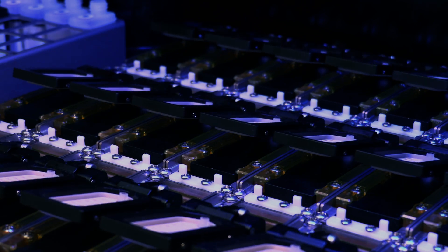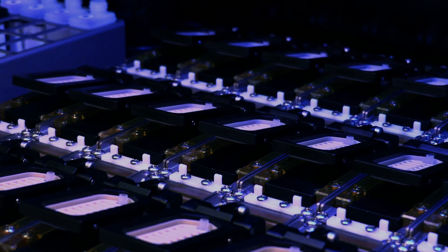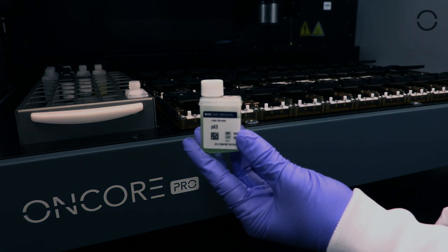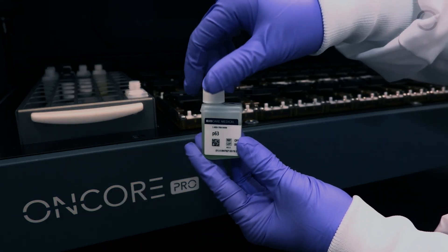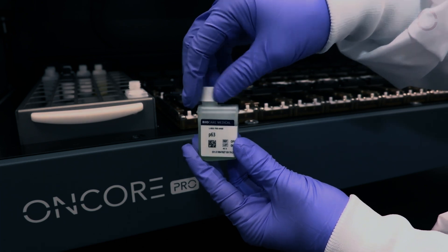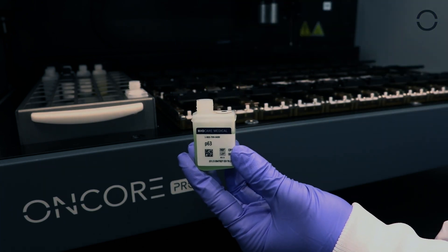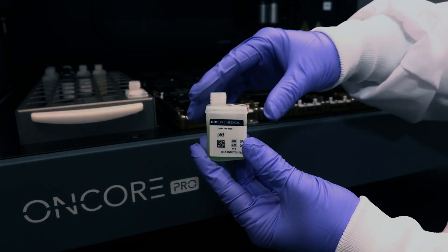Laboratories looking to increase their output are often faced with a choice: create more space or add more staff. But what if you didn't need to do either?